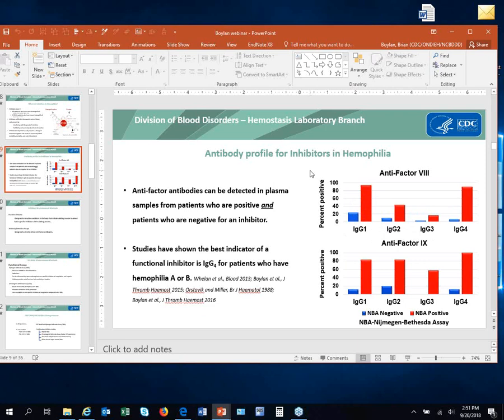So this is something that is on everybody's radar, but it doesn't seem to be a huge problem in these patients. But it's understandable that this is a question that patients in the hemophilia population are very interested in knowing because of the importance of inhibitor detection. So this is definitely something we are thinking a lot about and keeping our eye on. And yes, they have been looking into it, and a small number of anti-drug antibodies have been detected in these patients.